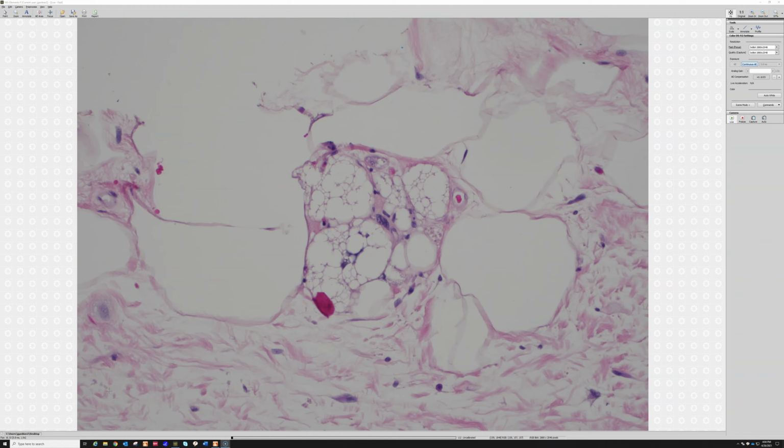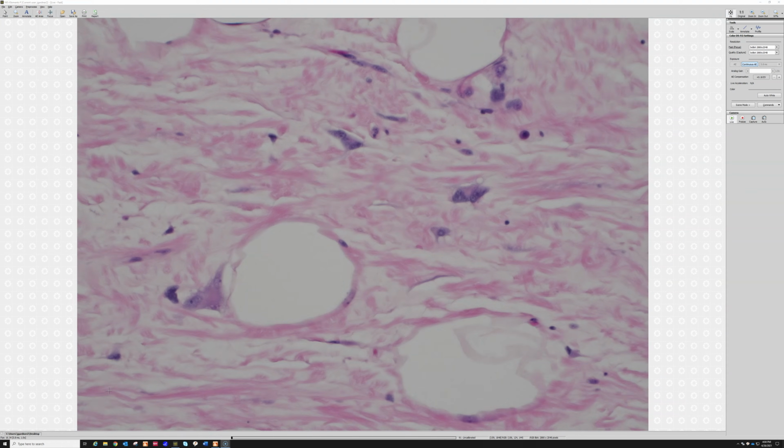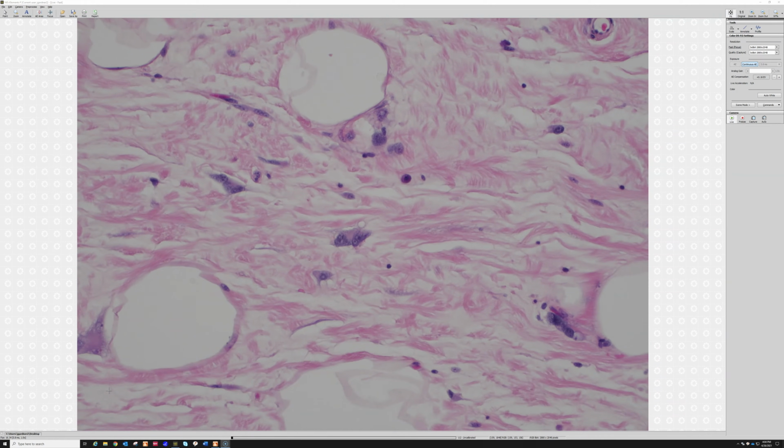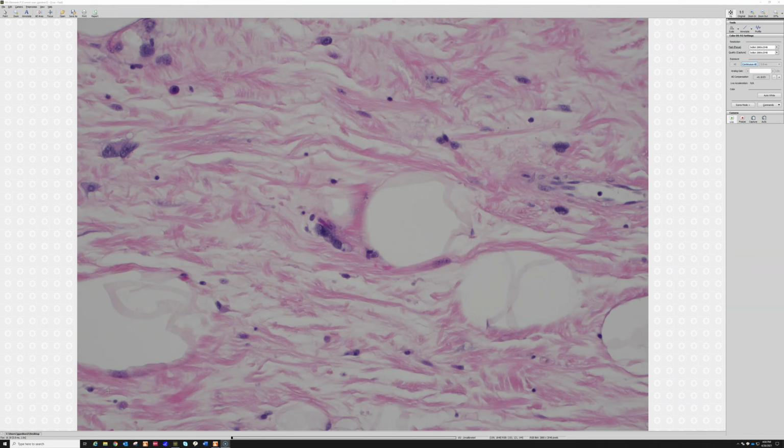I've seen people send in a case where they think it's a well-diff liposarcoma, and they've got dots all over, like 20 different slides on this huge mass, and they're dotting little bubbly cells that they're like, could this be a lipoblast? And right there, all over, are these big hyperchromatic pleomorphic cells, which again, that's the hallmark cell. That's the classic cell that I'm looking for to make a diagnosis. These hyperchromatic guys here. And something that Dr.